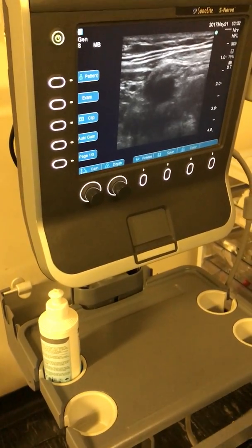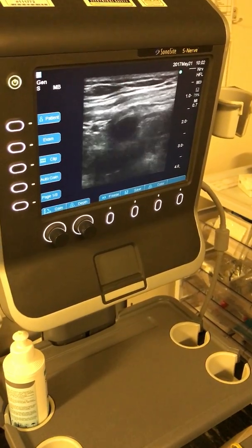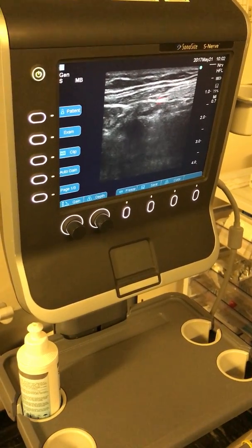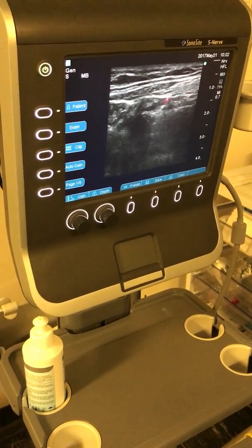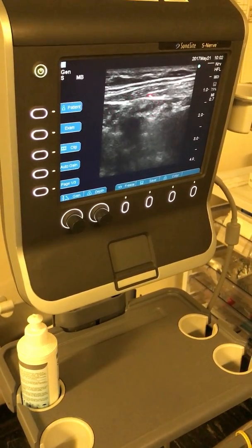This you should not do. It's not a lateral. It can be different. Turn the probe like that, the opposite way, and then come in. That's your fascia lata, fascia iliaca. Go in, inject in that area, because that's where I can see the nerve much better.